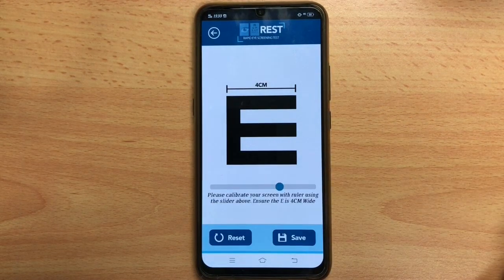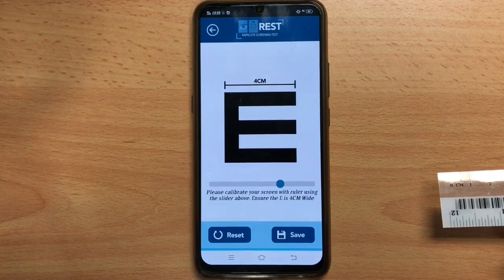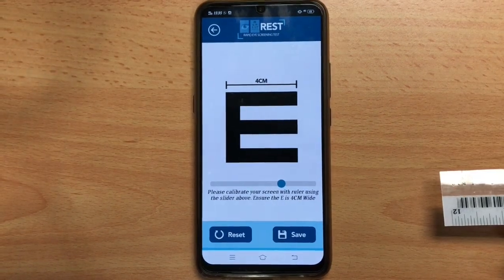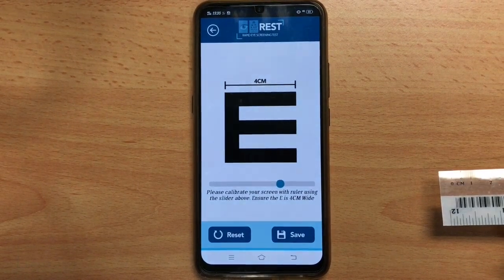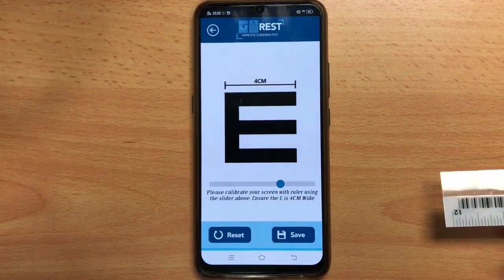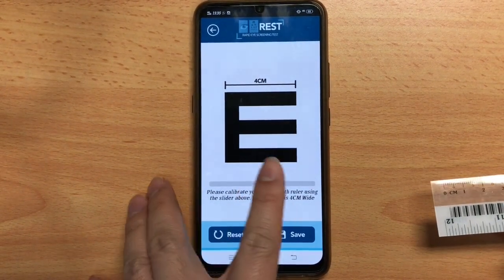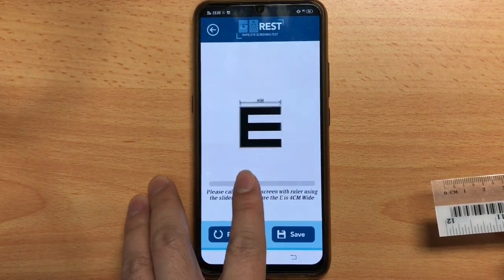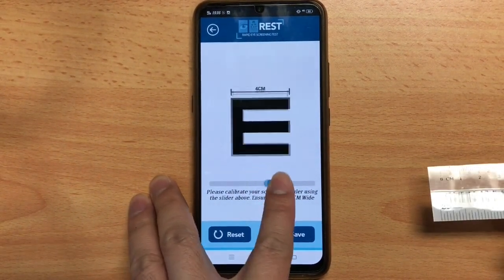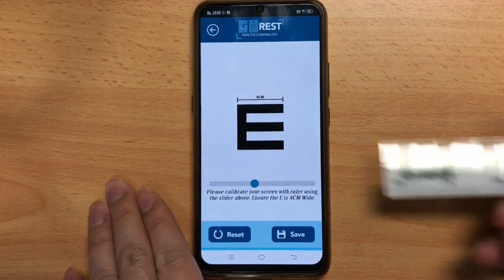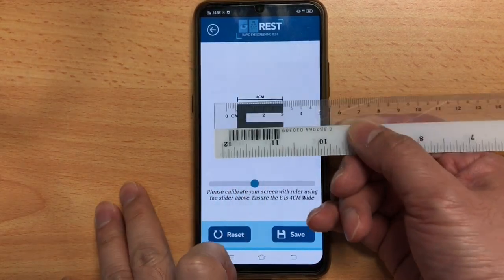Click on the setting tab and slide the slider on the screen to make sure that the on-screen E is 4cm, calibrated with a ruler.